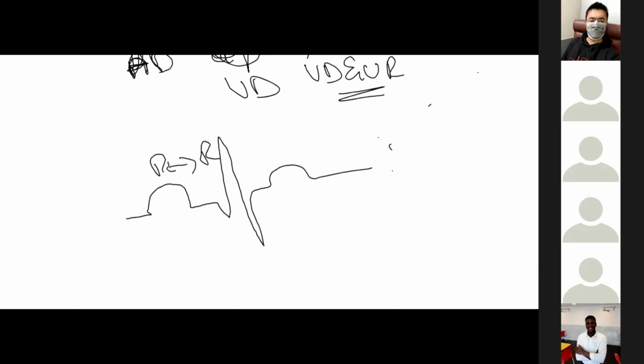Now we will discuss it individually, starting with the P wave. I will not go into detail at the moment, but I'll just give you a rough idea. Whenever you are reading the ECG individually, what will you do? Start with the P wave. What will you see first?